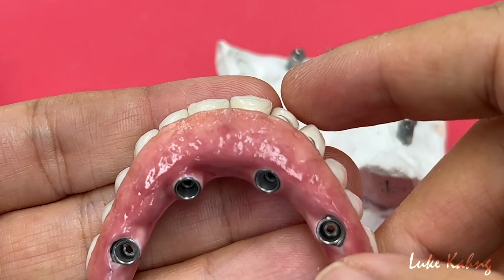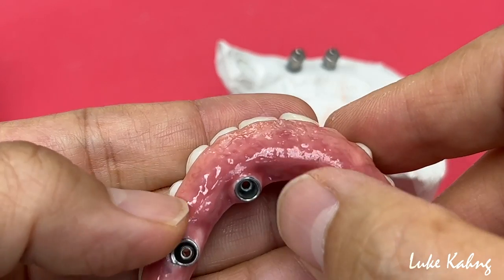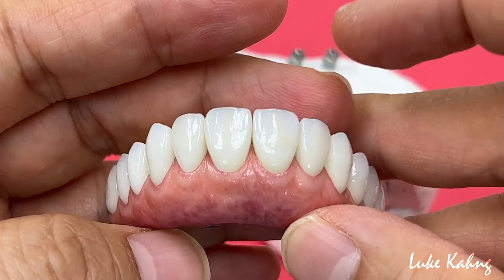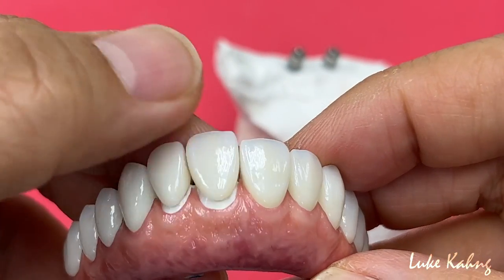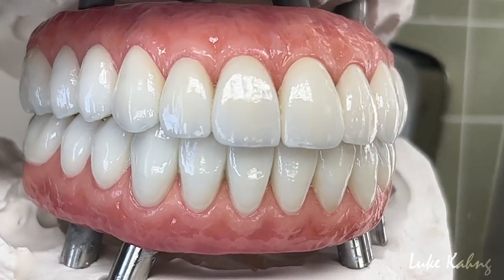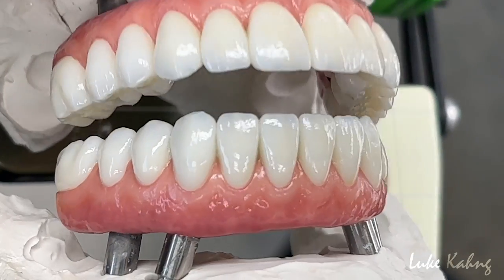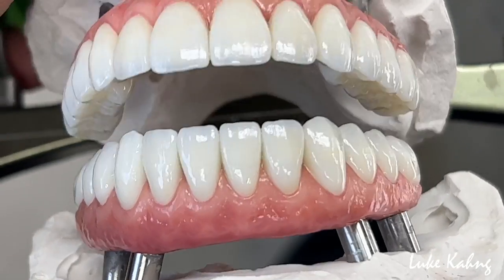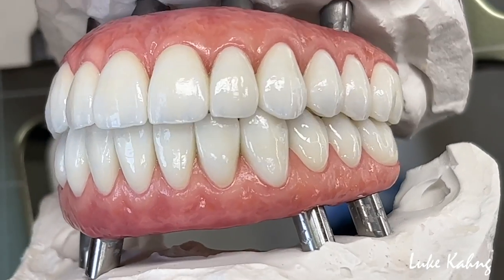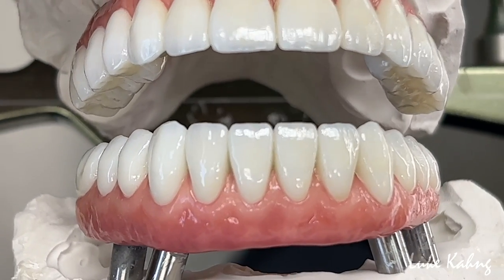And not only that, we put the gum colors and we put the very sophisticated design from the tissue, gum line, and tooth size, and the interproximal contact, and then make more layers and natural lifelike restorations, and even very thin. It's a long span, right? Lower long span, and then we bring from the class 3 and class 1 to make the perfect shape and contour for this patient. I illustrated from the design from the wax try-in, and how we make the better contour compared to the wax try-in. Looks like 2-3 millimeters more down, which they don't know, but I mean very slim.